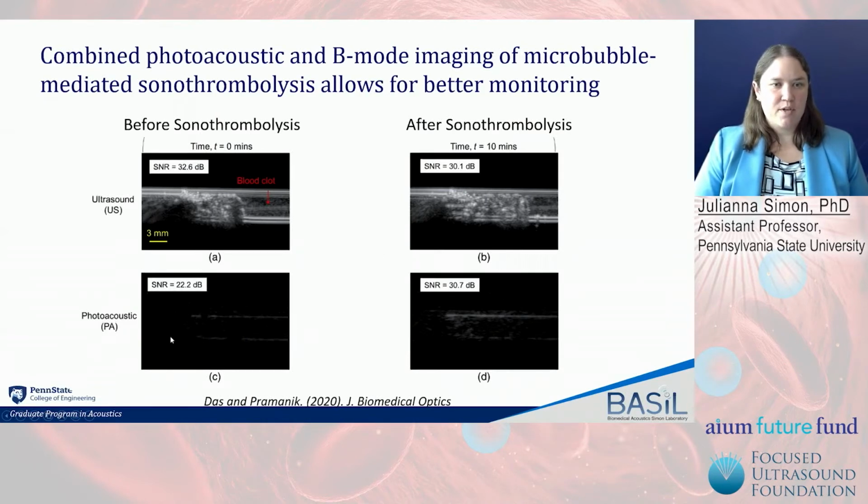This group claims that if we use photoacoustics, you do see that increase of signal between before and after sonothrombolysis that they expect is related to these microbubbles forming pores or channels, softening the clot and allowing more of a photoacoustic signal for better monitoring of how well the clot's broken up.